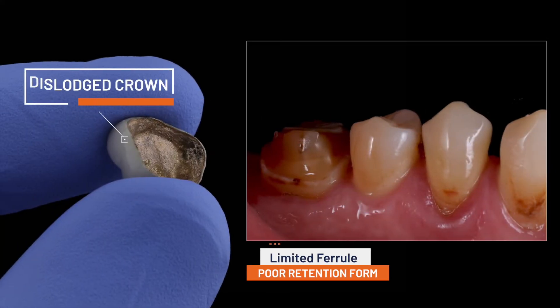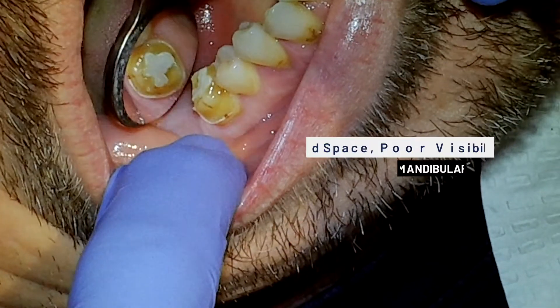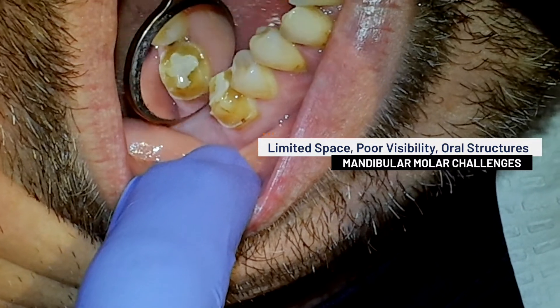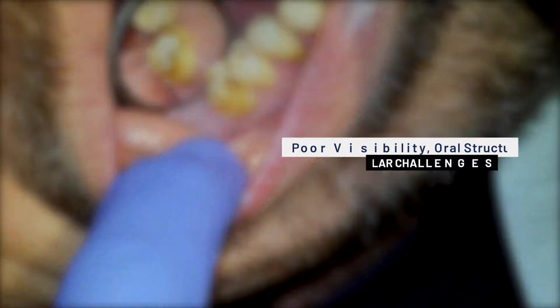In our second clinical scenario, we examine an all-too-common occurrence: a dislodged crown with poor retention and recurrent decay. Unlike maxillary anterior tooth preparations, the limited interocclusal space, poor visibility, and oral structures such as the tongue and cheeks make working on mandibular molars a unique challenge.